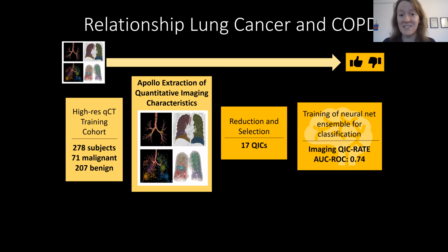But moving beyond that question of disease state and what we can learn from each of these based off of the features that we had pulled, I mentioned before these weren't the only characteristics: texture and intensity, border and shape and size. They were a selected few. So we looked a bit more at how this modular tool can be applied to different features, and specifically ones that are related to other diseases of the lungs.